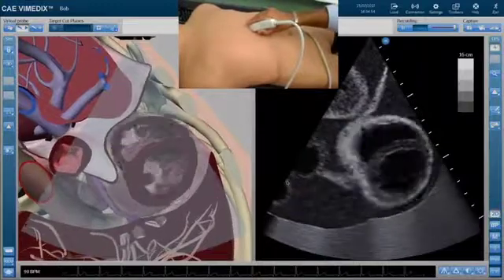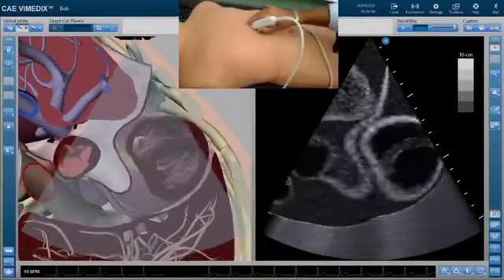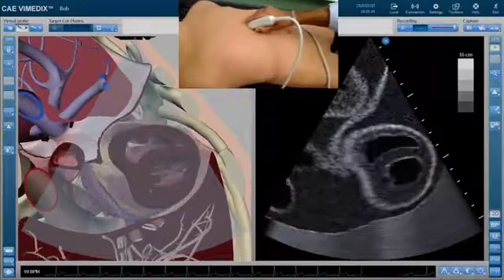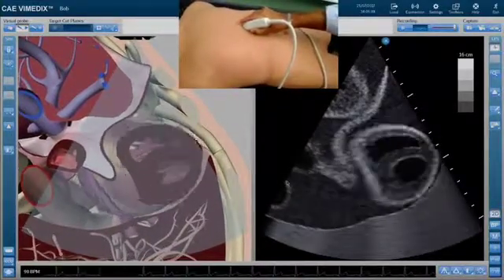position. So here hopefully I've been able to show that the subxiphoid window can be a very useful window to evaluate the heart and get similar images as you would get from the apical and parasternal views, simply by adjusting the rotation and the angle with the skin in the subxiphoid space.